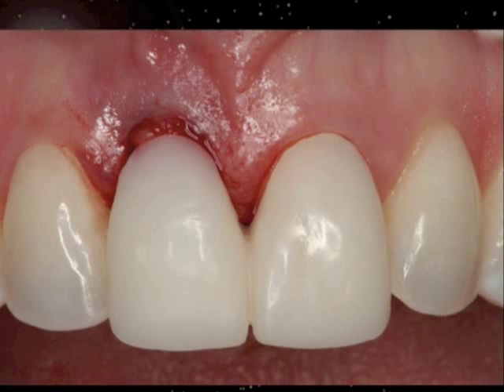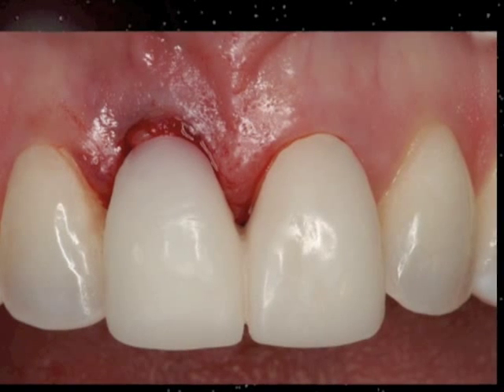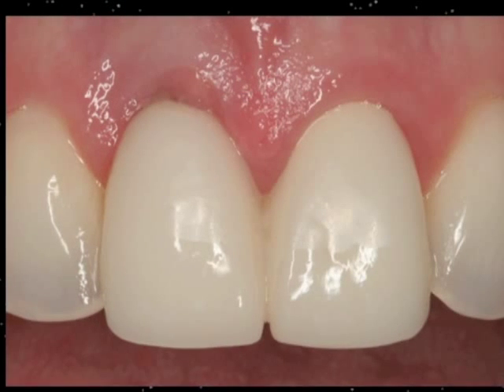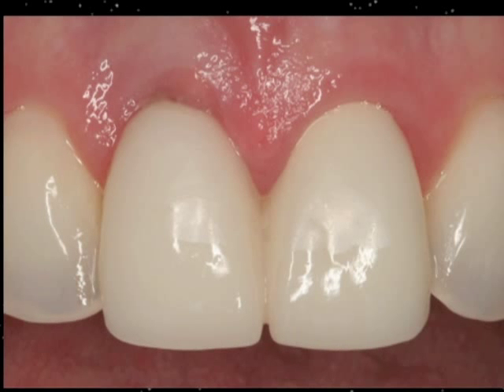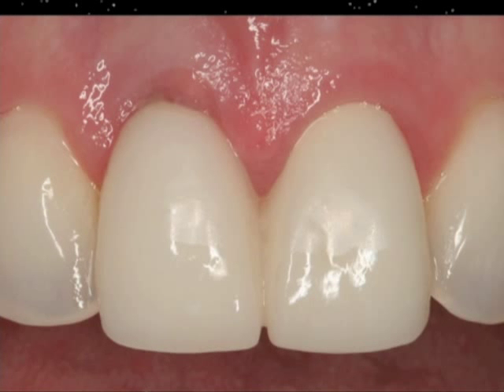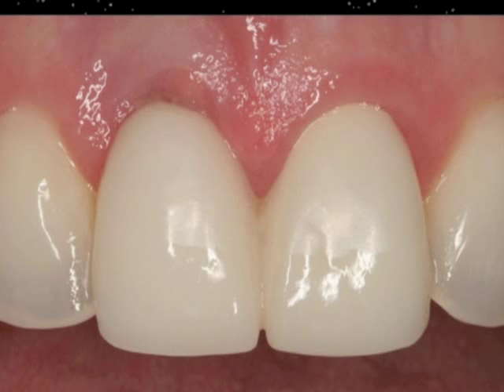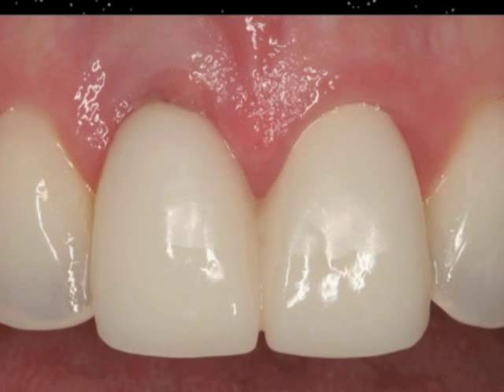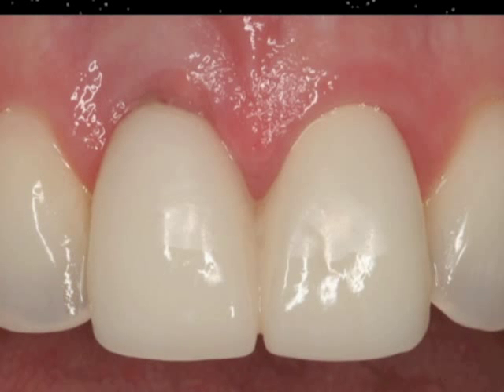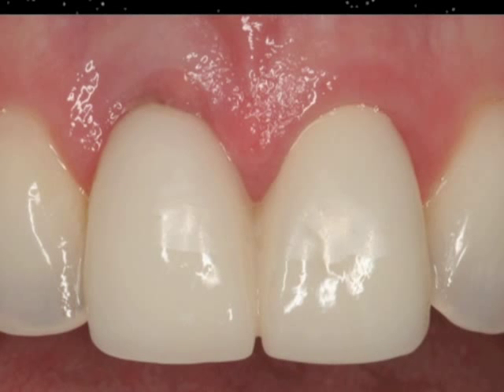And here you can see the day of the implant placement and the provisional restoration placed on the implant and the natural tooth, and what healing occurs over several months' time. What happens many times is patients get these two new front teeth and they realize how great they're going to look, they oftentimes want to perk up their smile, and they'll do ancillary treatments such as bleaching their teeth, which you have time to do because these temporary restorations will sit on the implant and the natural tooth for 2 months before they're eventually transitioned into porcelain final restorations.